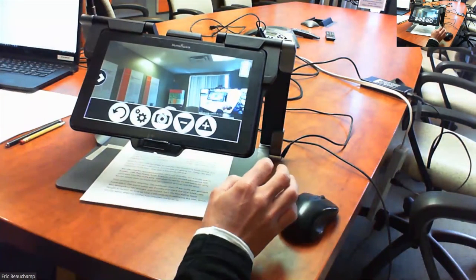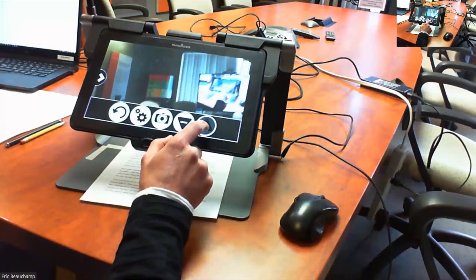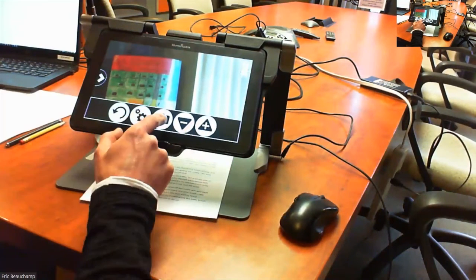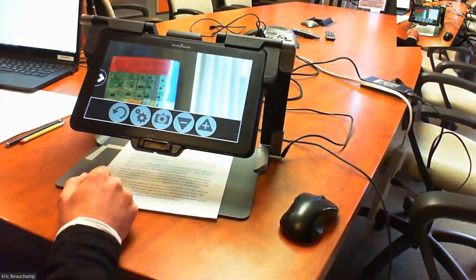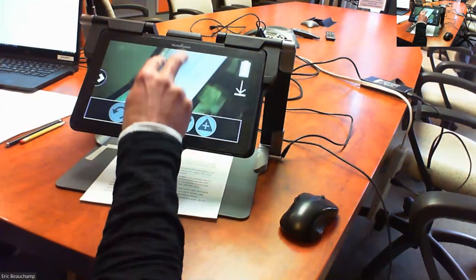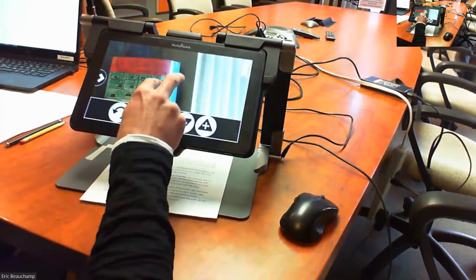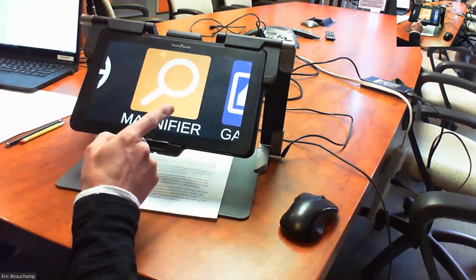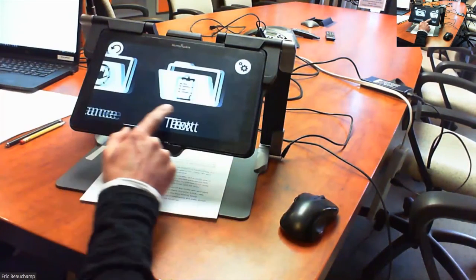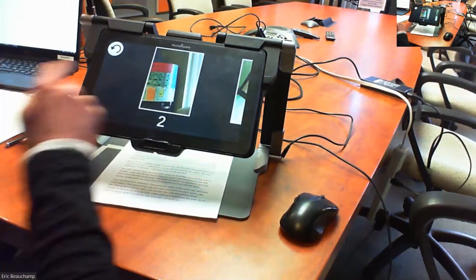So let's say I have this here. I'm gonna zoom into my poster. There we go. So I can capture this, capture, and that capture is going to be stored directly into my gallery application. And again, that two-finger double tap is very useful to come back to my main menu. Double tap back into my main menu, go into gallery, and you'll have here in my gallery a distance folder. So go in that distance folder and you'll see my capture that I've just done here.